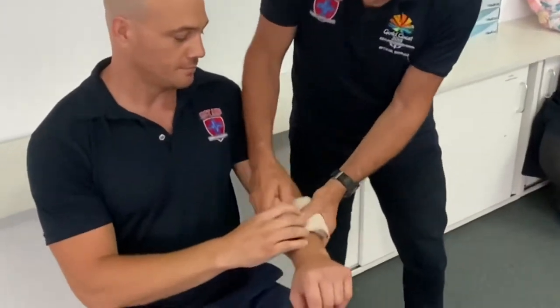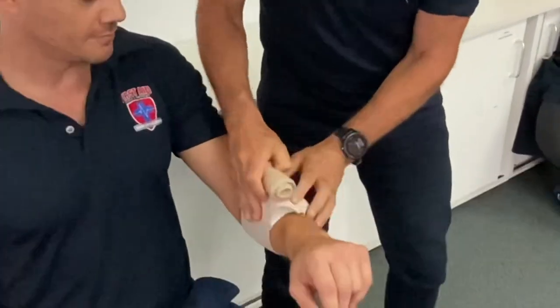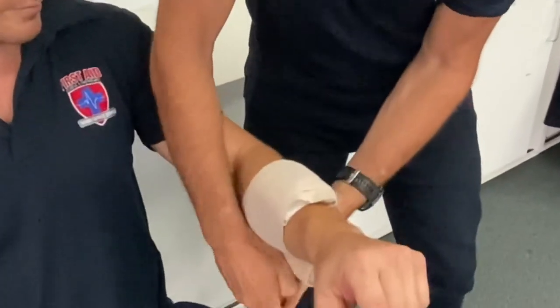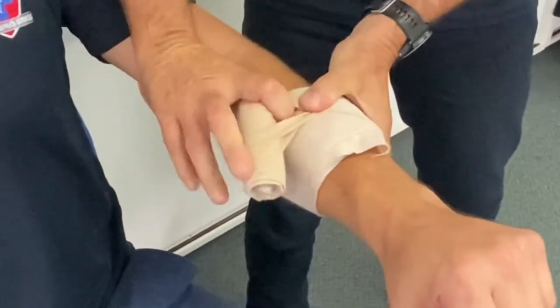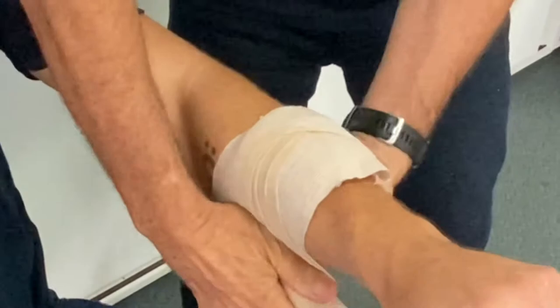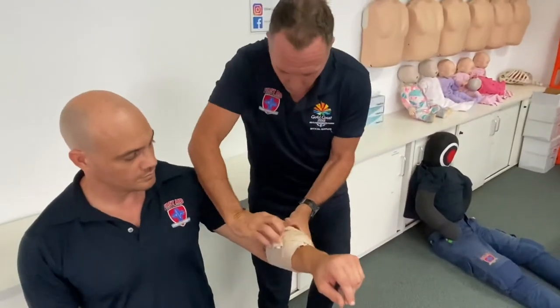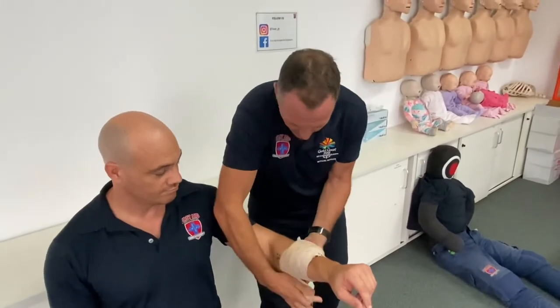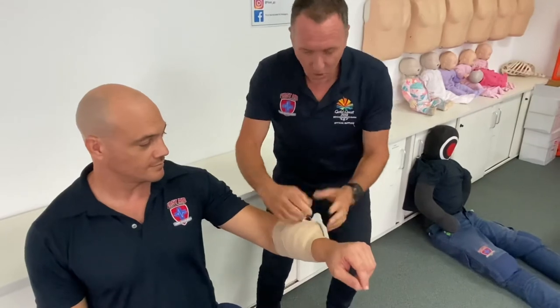We go over the top of the bandage like this — we'll get our compression bandage on there. Once we've gone over once or twice, I'm going to get some extra pressure in this area here by twisting the bandage, so a bit of pressure directly over the wound to help control the bleeding. Then just a few times either side and tuck it in.